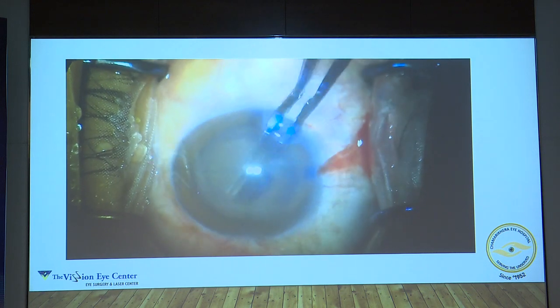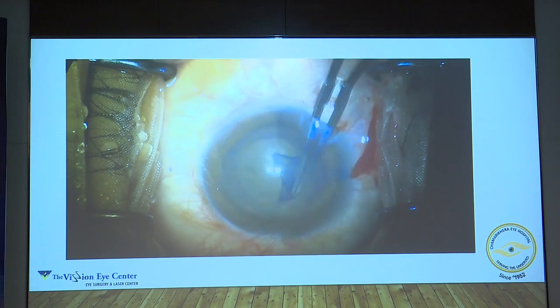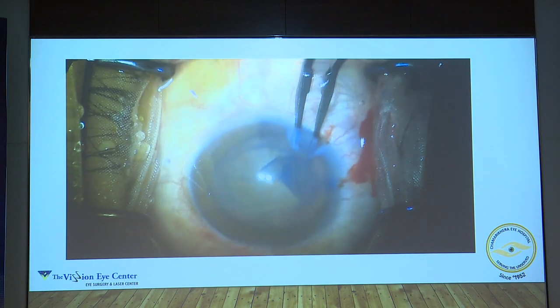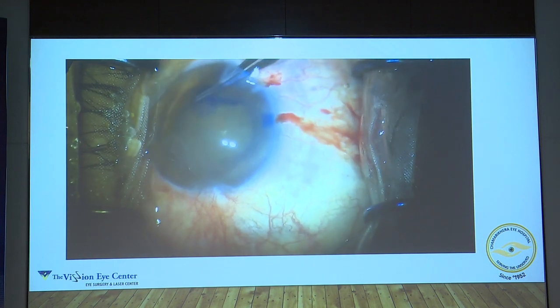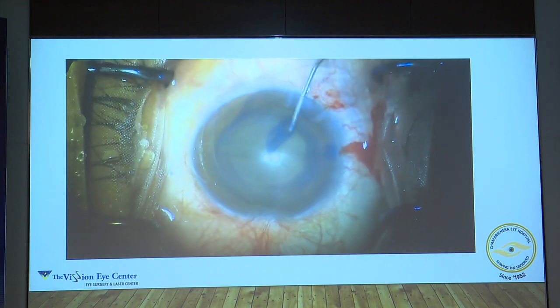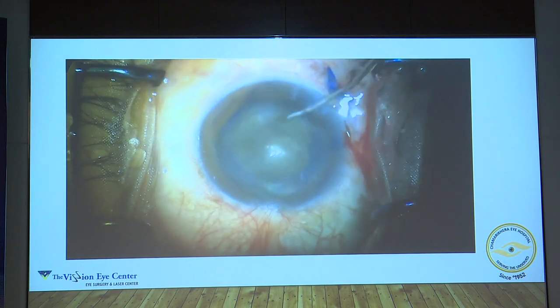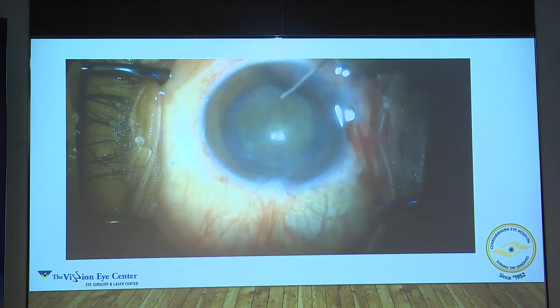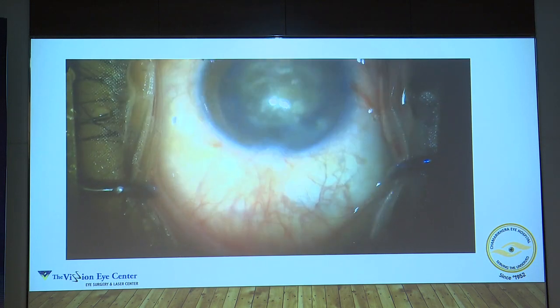Here's a case — a hard brown cataract. You've got to make sure that you get a good rhexis. Once you have a good sizable rhexis, that's only half the job done, especially in a brown cataract. What one needs to make sure is that hydrodissection is done and it's a freely rotating nucleus. Once it is a freely rotating nucleus, your maneuverability increases manifolds.